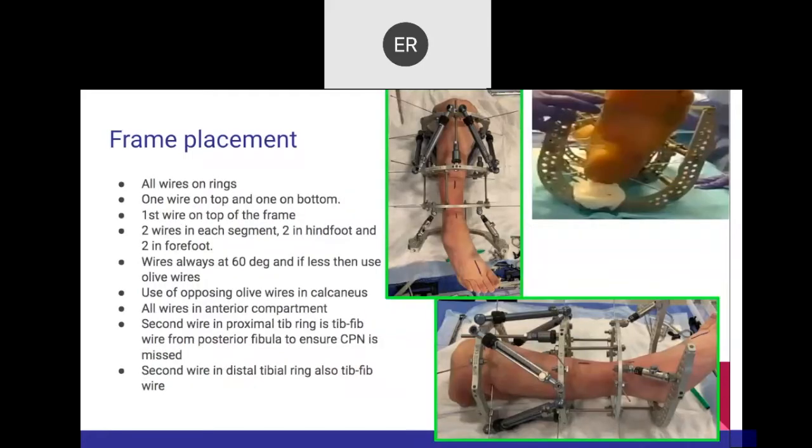On the frame, the first ring is at the tibial tuberosity. Both wires enter — the first wire entering the anterior compartment, the second one below is tibial-fibular. Moving to the distal ring, same thing: the one on top is in the anterior compartment, the one below is tibial-fibular. The angle is 60 degrees throughout, and a template ensures all wires are lined up.